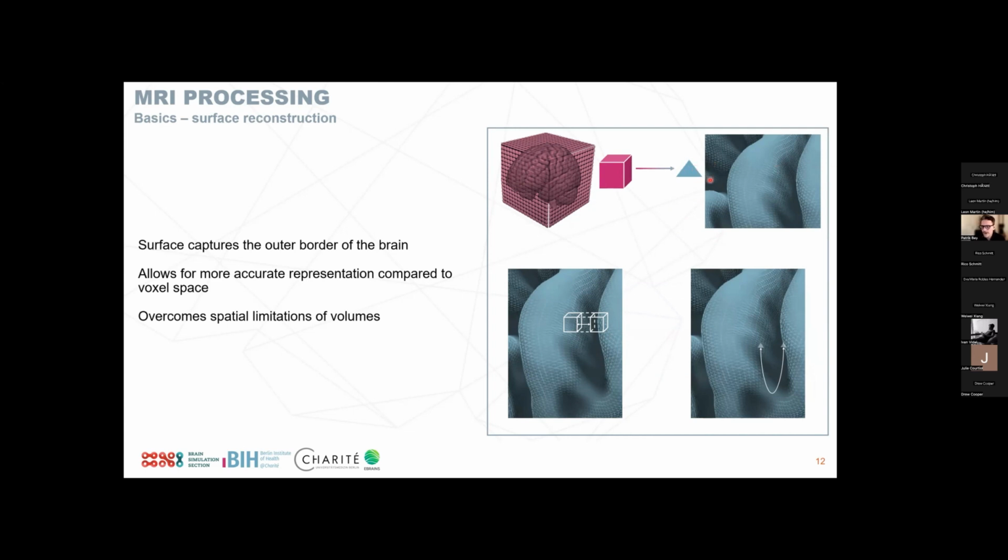This triangular mesh is standard in computer vision, etc. So it's easy to map this and actually solve the optimization problem there to have a good representation of these triangular surfaces that allows for a very fine-grained alignment along the surface. So we get away from this clunky 3D representation of the voxels into a smooth overlay of the actual surface, which helps us solve some of these limitations of the spatial approach, this volume approach.